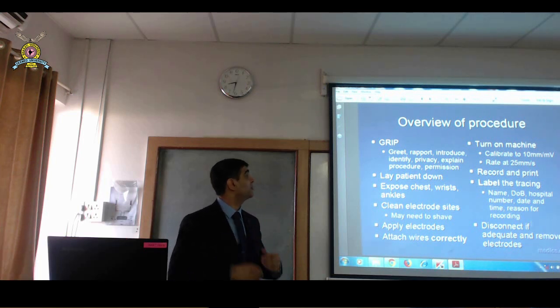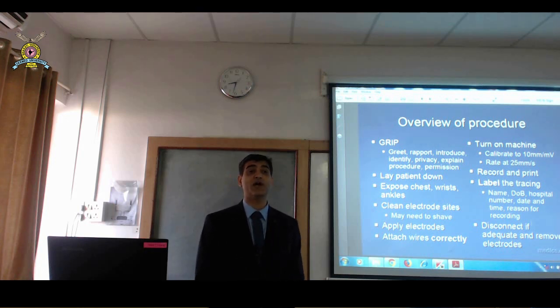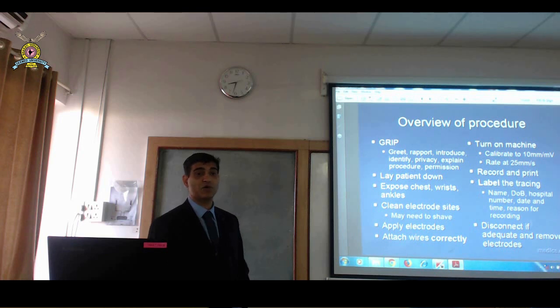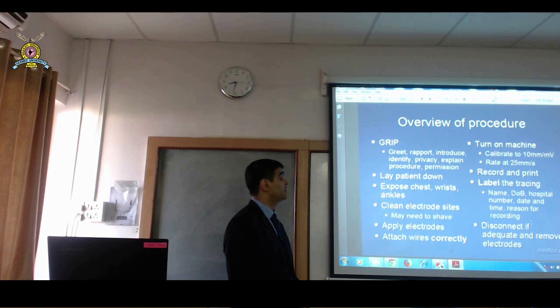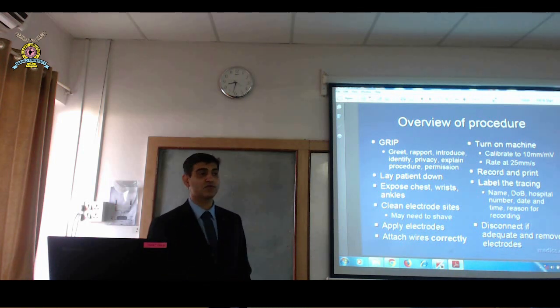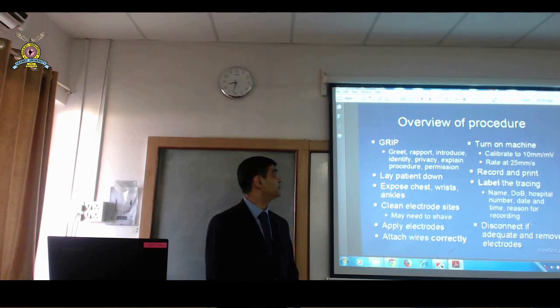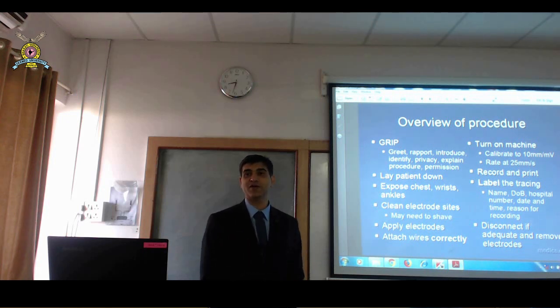So identify yourself, or tell your staff member to identify themselves, who they are: I'm a nurse, I'm a nurse practitioner, or whatever their role is. Then explain the procedure: that we're going to put the clips on, some electrodes will be placed on the chest, and we're going to do your ECG. And permission: when they agree to come in, it's a verbal consent. You don't need written consent for an ECG.